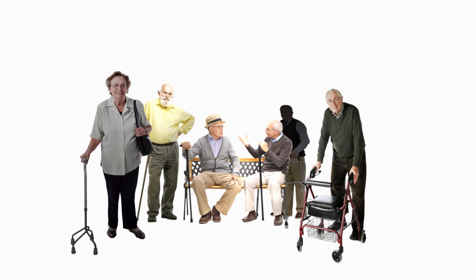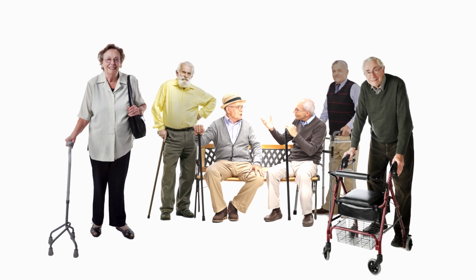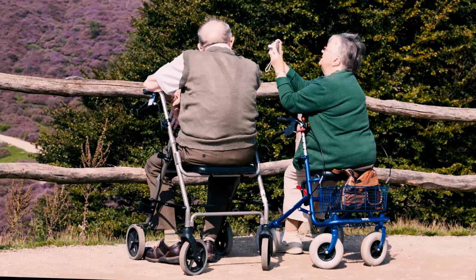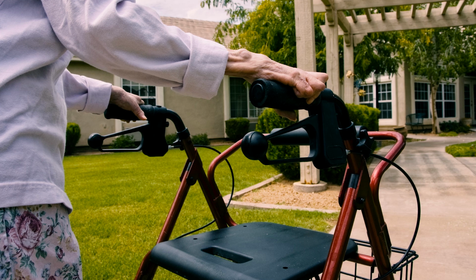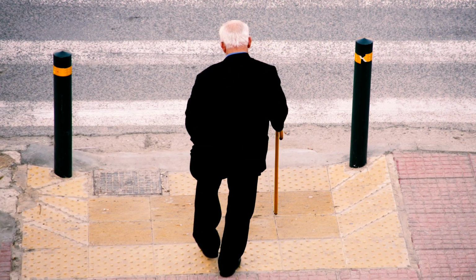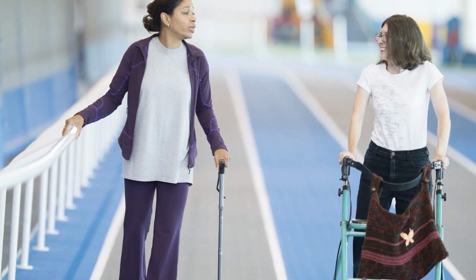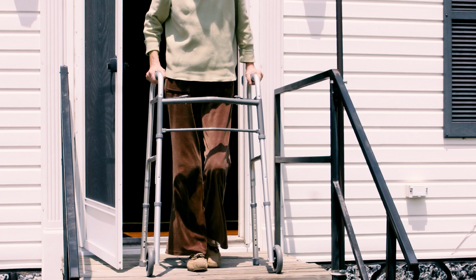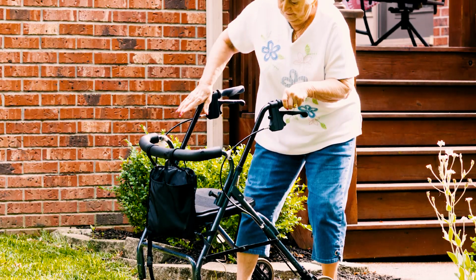Using the right mobility aid can reduce the risk of falling, reduce pain, compensate for neurological impairment, and improve confidence. Unfortunately, some of these aids are acquired through informal sources without seeking advice from a health professional. As a general rule, the larger the mobility aid, the more stable it becomes. However, the trade-off is walking speed and access to different environments, which is often reduced.